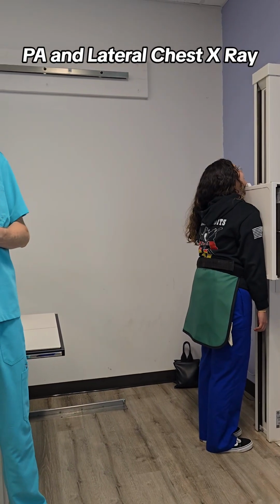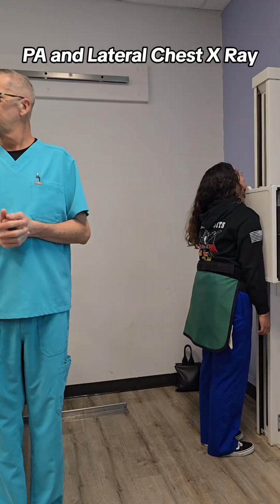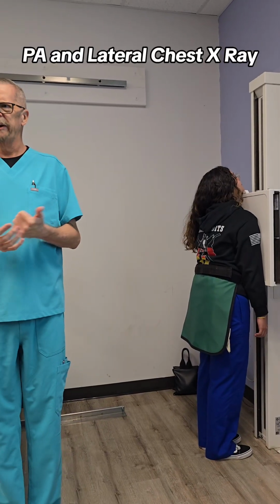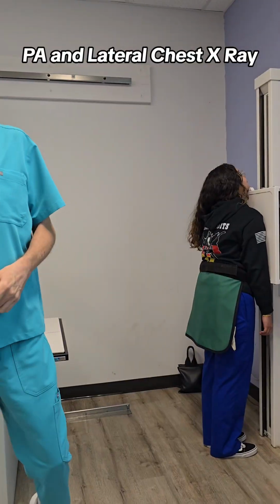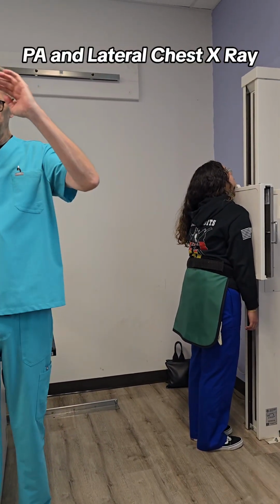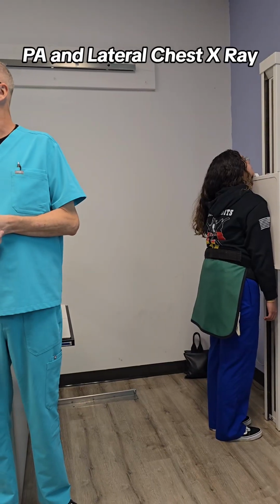Don't forget to tell your patient to breathe. I've had a lot of students with patients still standing there, and I'm like, hey, you might want to tell them, and they're like, what? Your patient's not breathing yet. Oh, you can breathe, and the patient's all about to pass out. Don't forget to tell them that. When you first start, you're going to think of everything and you're going to forget something. It's going to be to tell your patient to breathe again.